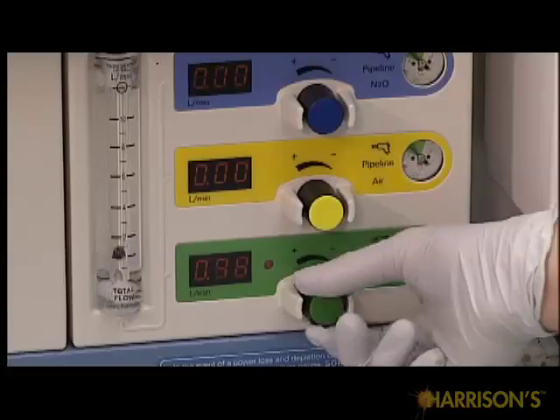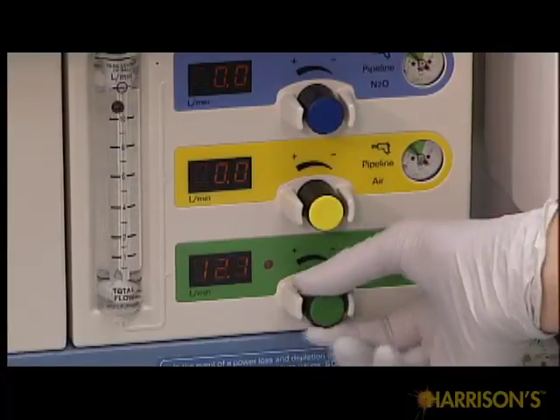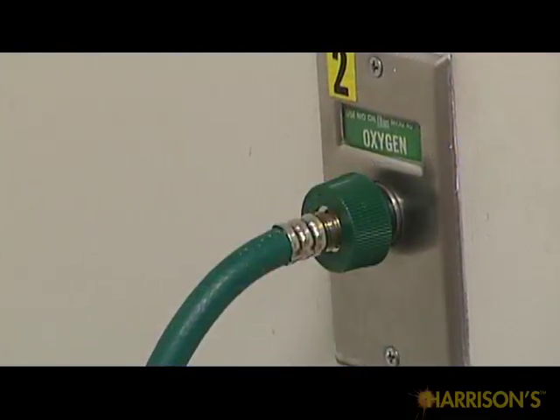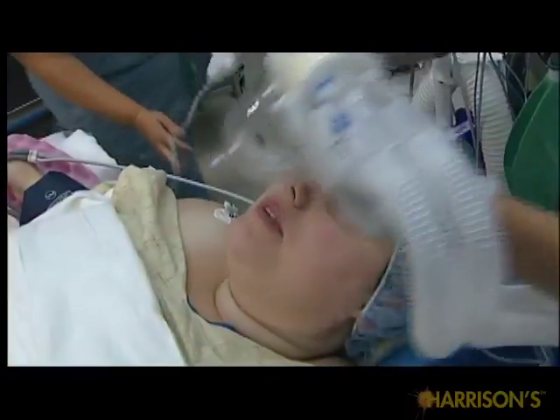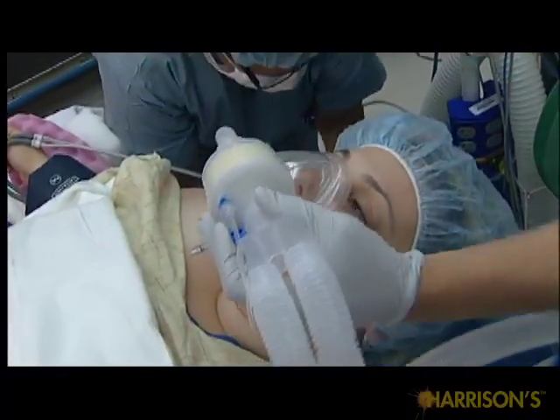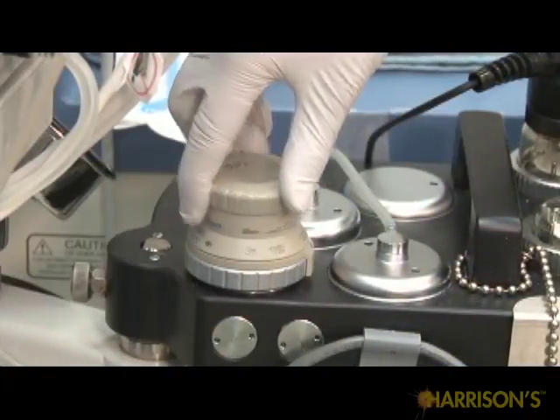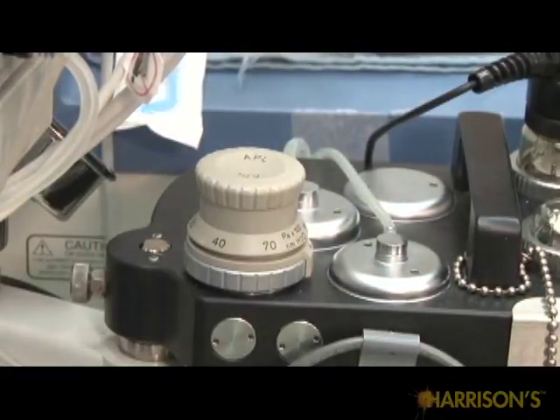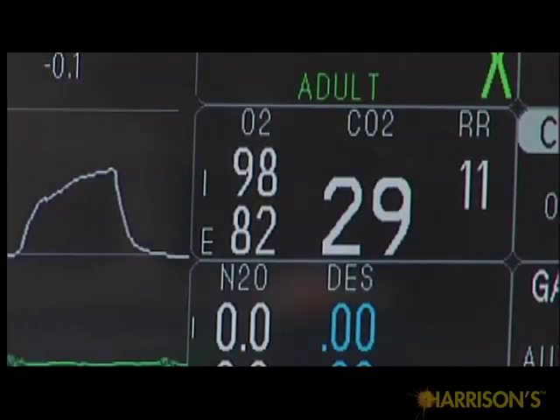Pre-oxygenation with 100% inspired oxygen replaces the nitrogen in a patient's lungs, which increases the time that a patient can remain apneic without desaturating. Perform pre-oxygenation by using high-flow 100% oxygen. Have a tight mask fit to prevent the entrance of room air, and allow the patient to breathe spontaneously against an open pressure relief valve for 3 minutes or 4 vital capacity breaths before inducing anesthesia. Pre-oxygenation is adequate when end-tidal oxygen approaches 85 to 90%.